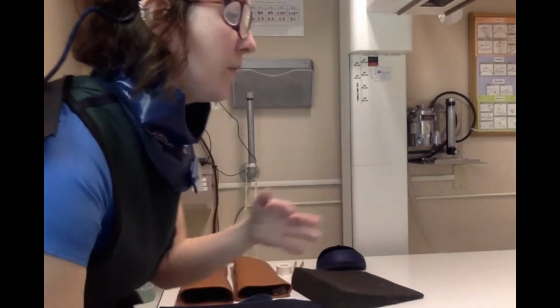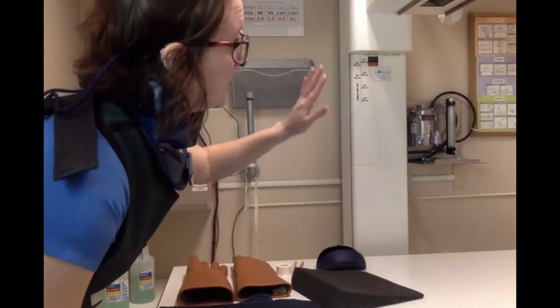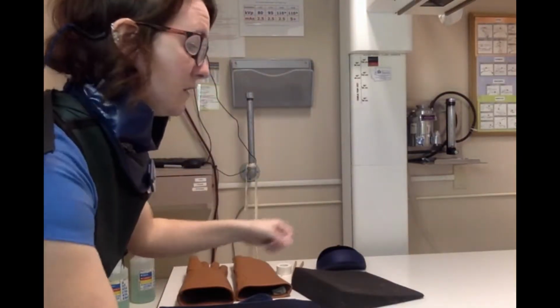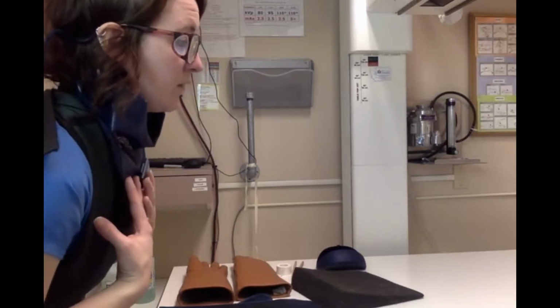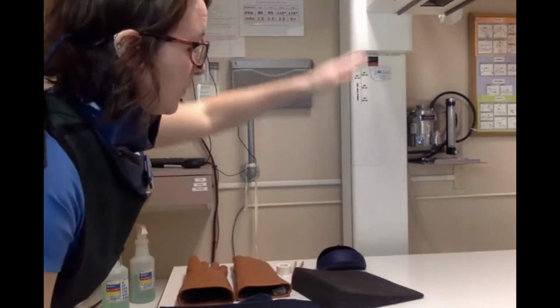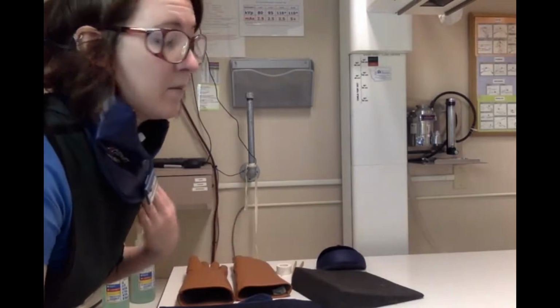Any non-essential personnel should be removed from the x-ray suite, because we want as few people as possible to be subjected to the primary x-ray beam, and also we want to stay as far away from the patient as possible, because we just want to make sure the fewest amount of people and the smallest part of us is subjected to any radiation because some of the photons can come down, bounce off the table, or bounce off of the patient. That's called scatter radiation, and that can come back and hit us too.